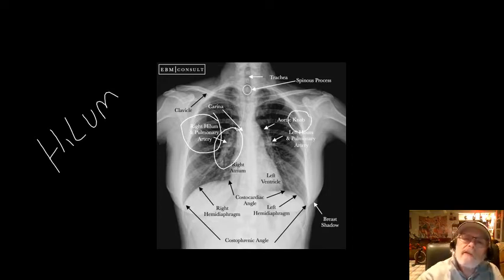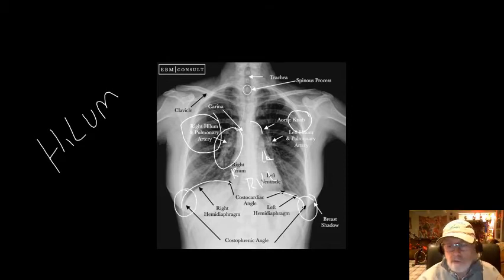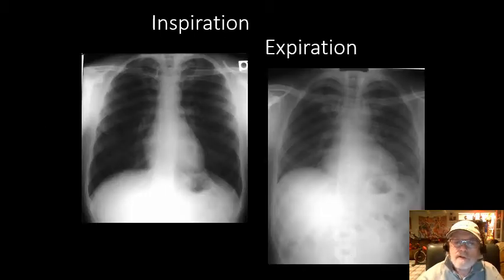See, they use the word knob here. Here's the aortic knob right there. Here's the left ventricle, right ventricle view right here, right atrium, left atrium would be sitting up in there. See the left hemidiaphragm, right hemidiaphragm that's in there, costophrenic angle. All these things are really important. Again, with the more chest x-rays you look at, some of these things are going to be quite prominent to you. You'll be able to see those things.